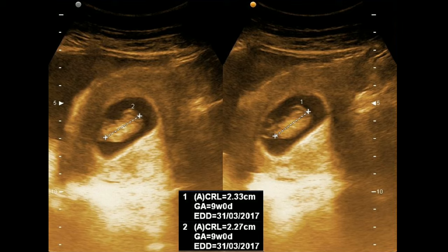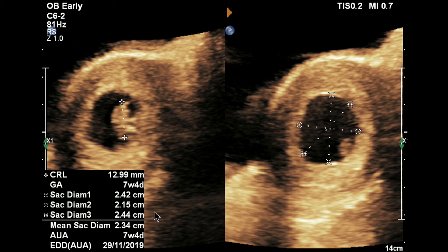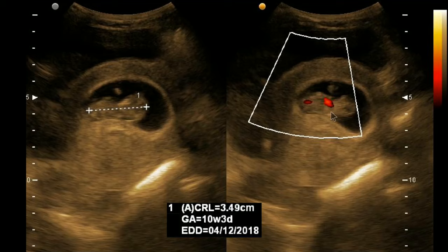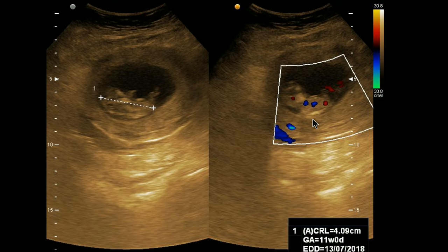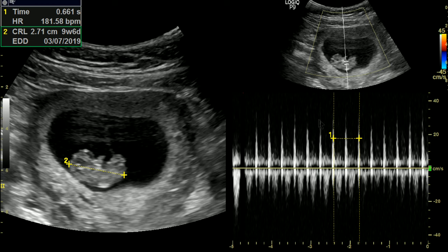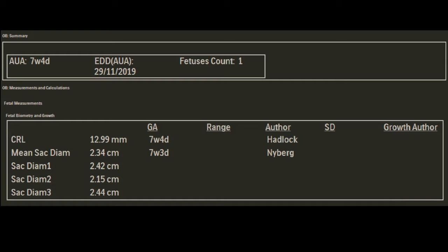I took CRL twice to avoid error and both say nine-plus week gestation. Here I have measured MSD and CRL and both suggest 7 weeks and 4 days of gestation. As both results are the same, I am very confident about my result. Try to use more than one parameter if possible. Another CRL measurement and you can see the cardiac flow on power Doppler. Again, CRL measurement with cardiac flow on color Doppler. Here with the CRL I have included a pulsed Doppler heart rate measurement. You can check all your results from the worksheet or result option on your machine.